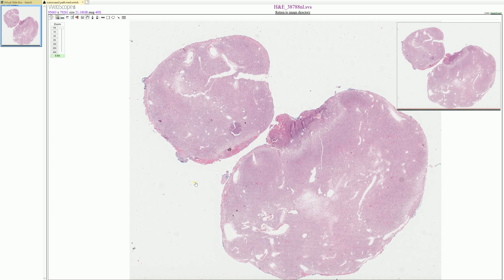So what we're going to be talking about today is a lesion that was in the brain or spinal cord. The neurosurgeon went in, took the lesion out, gave it to me, the pathologist, and now I'm looking at it under a microscope to make a diagnosis.